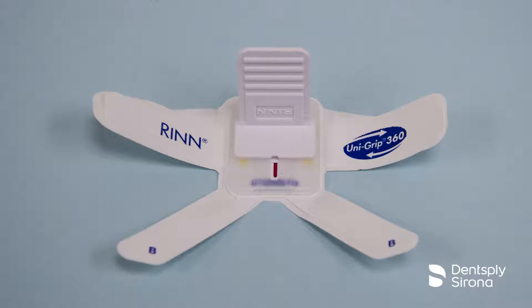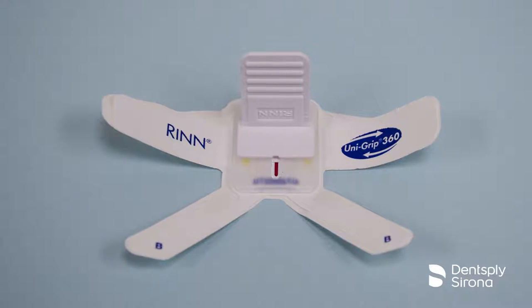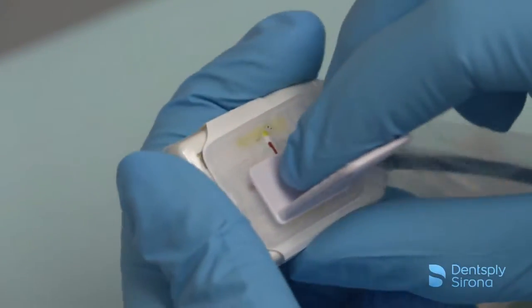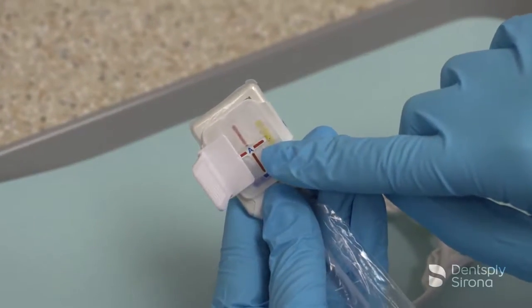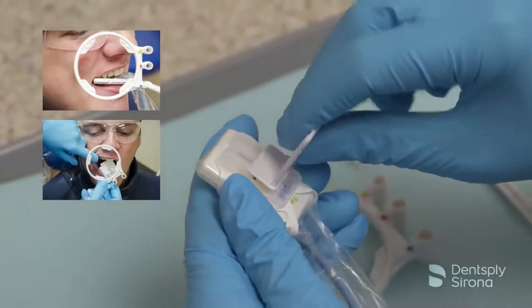The UniGrip Universal Sensor Holder is designed to provide an entire full mouth series using only one holder. This video will demonstrate the time-saving feature of the UniGrip 360 holder and its easy rotating tab. This rotating tab allows the clinician to slide the bite piece along the channel, enabling the clinician to take anterior, posterior, and bitewing x-rays.